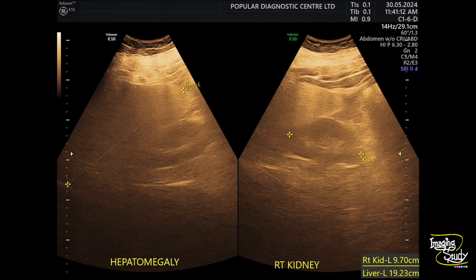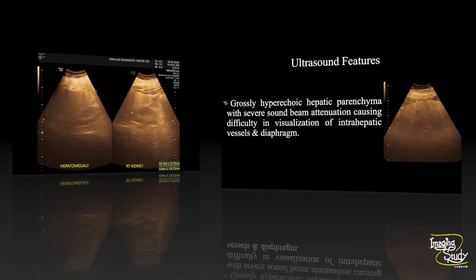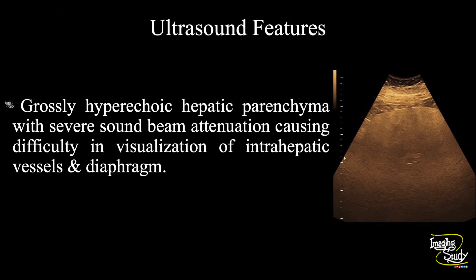Whatever measurement you follow, make sure that CT will give you the best measurement in severe hepatic steatosis cases. In summary, grossly hyperechoic hepatic parenchyma is noted with severe sound beam attenuation, causing difficulty in visualization of intra-hepatic vessels and diaphragm, suggesting this as a case of severe fatty change in liver — or severe hepatic steatosis — that means grade 3 hepatic steatosis.